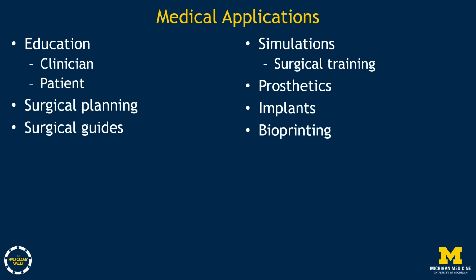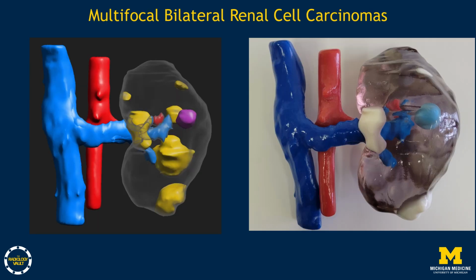Medical applications of 3D printing include education of the clinician and the patient, surgical planning, and also surgical guides. Simulations for surgical training, prosthetics, implants, and bioprinting are also possible. An example of multiple bilateral renal cell carcinomas in the model on the left-hand side shown in yellow, and on the printed model in white on the right-hand side.